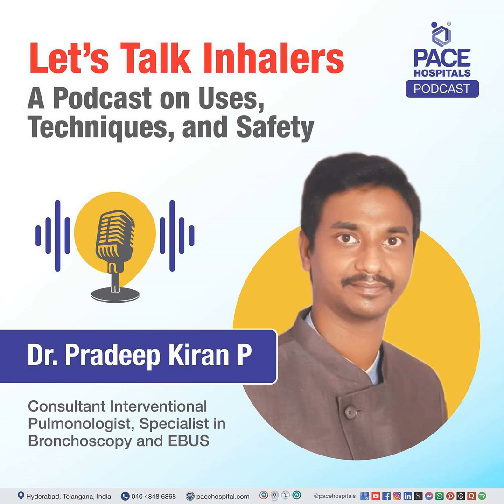Dr. Pradeep Kiran, how to use a meter dose inhaler with a spacer device? Coming to demonstration of a spacer device. This is one kind of spacer device. There are a number of spacer devices, of types valveless and with valve. So this is a spacer device where there is a valve inside here, which you can see. The valve will be opening and closing.